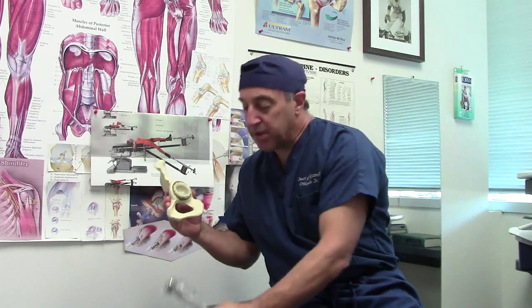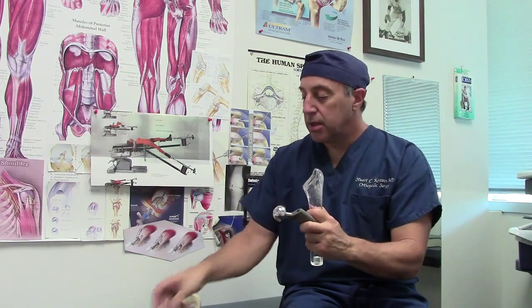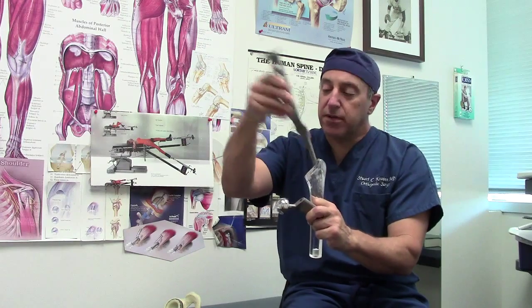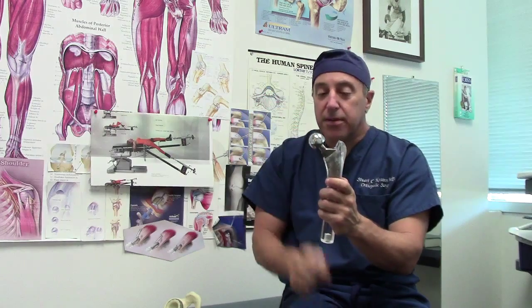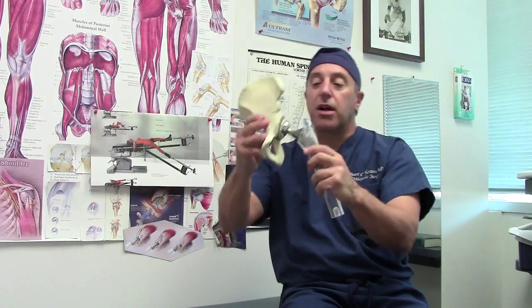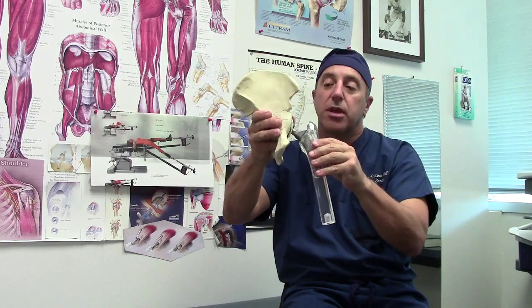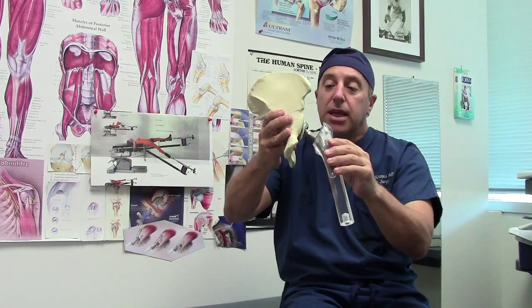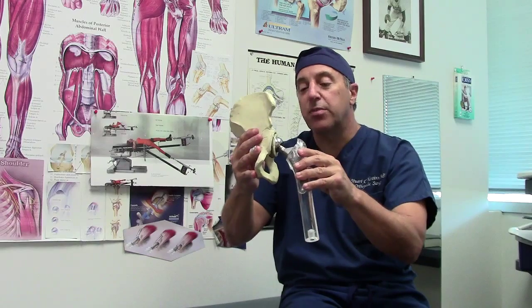On the femur side, I'm able to work the femur with a special rasp that creates the space for the implant. The implant is titanium, and it fits inside the femur. The final construct is a metal femur with a metal socket and a plastic liner — and that's the anterior hip. The remarkable part is I was able to get this device in without cutting any muscles.